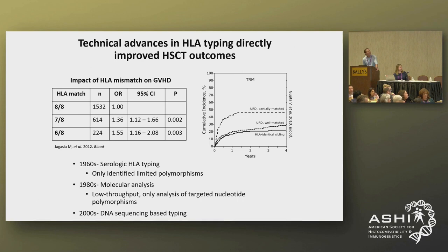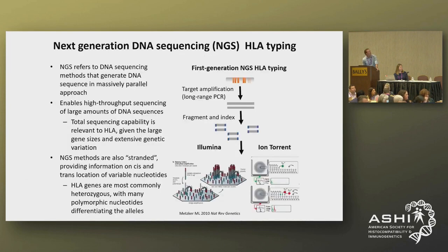As DNA sequence analysis came into the clinical labs, we were able to identify that the issue for stimulating the immune system wasn't simply that it was an unrelated donor, but really the degree of mismatch that was driving the outcome. Again, through technological advancement in how we provide HLA genotypes, we were able to change clinical practice and really facilitate MUD transplants in BMT.